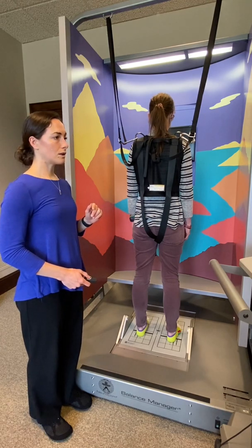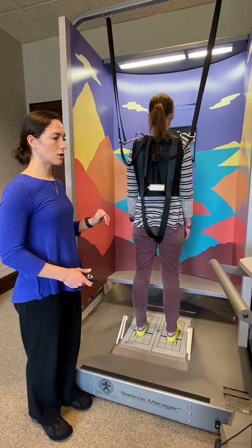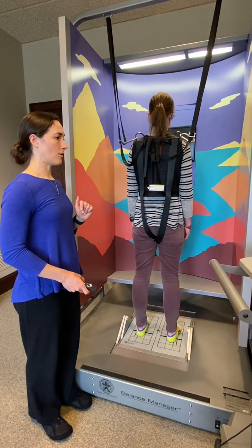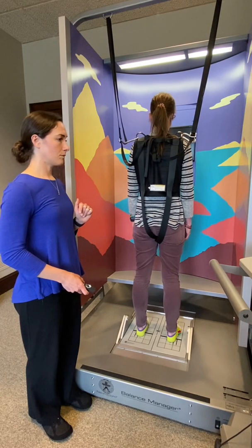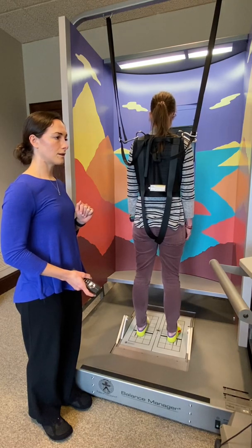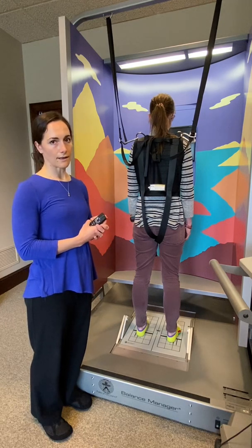Now let's go to condition four, just so you can see how the floor might move. So Jill, it'll be eyes open for 20 seconds, the floor might move. I'll begin the test starting now. And I'll stop the test. Normally that would go on for 20 seconds and we would do two trials of each test.